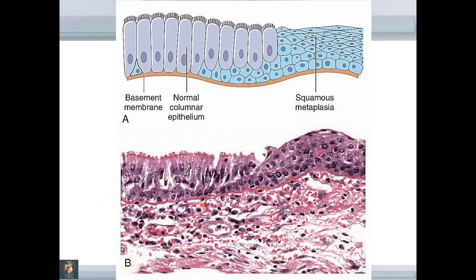In this slide, you can see normal columnar epithelium being transformed into squamous epithelium within the same tissue. This transformation is a change in epithelium in response to a chronic stimulus — chronic inflammation or chronic infection. This change, where columnar epithelium is transformed into squamous epithelium, is known as squamous metaplasia, which is an example of cellular adaptation.